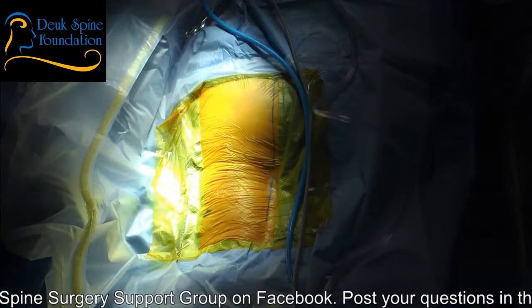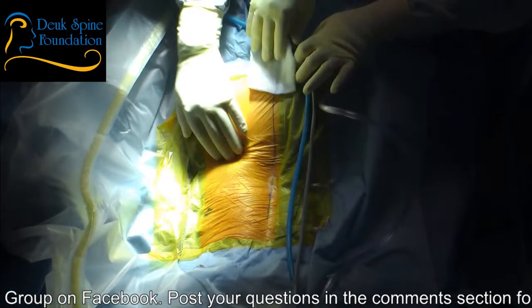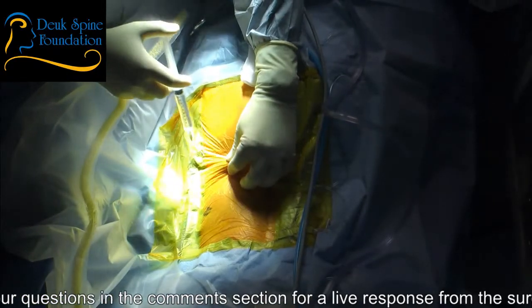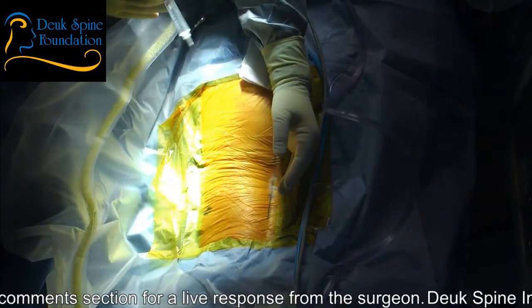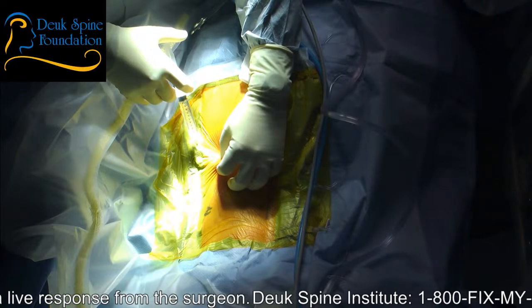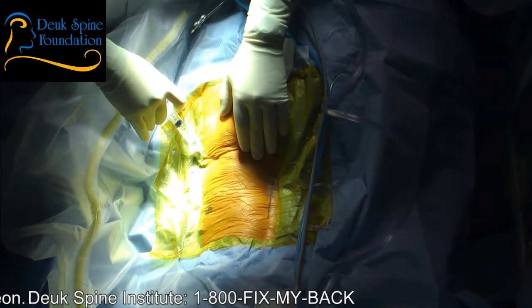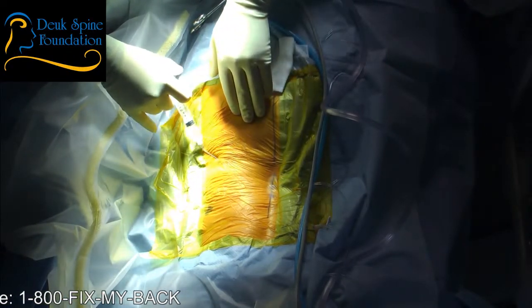If you have questions during the surgery, feel free to ask. That is my hand on your back. I am going to keep you awake for a few minutes to help me. I am going to give you some numbing medicine in just a second — you will feel a little stick and burn. If you feel any pain, just say ouch. Don't try to move or get off the table. Are you comfortable? I am going to be talking to you and some other people as well while we are doing the surgery.